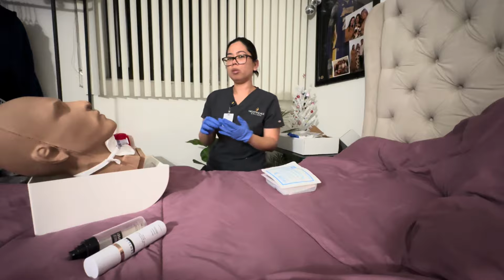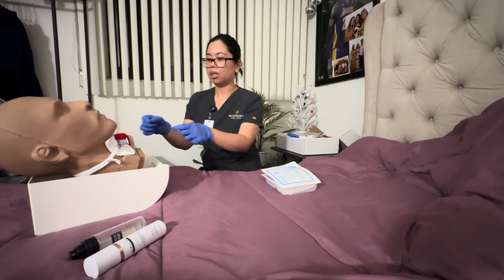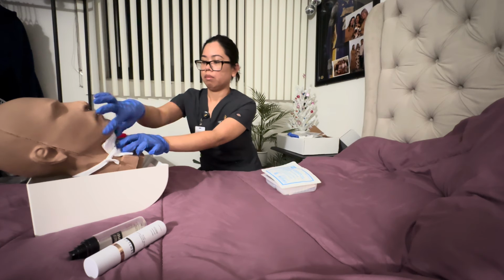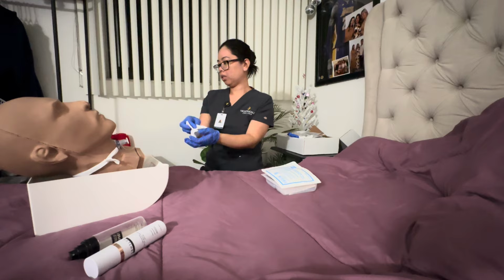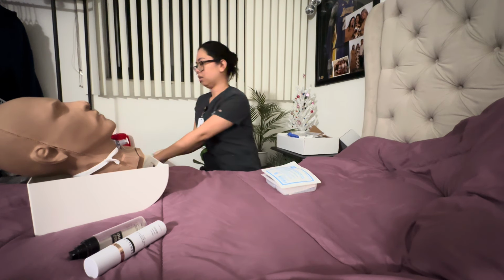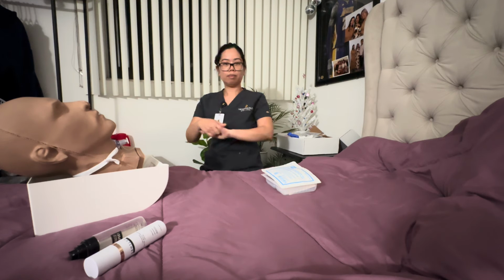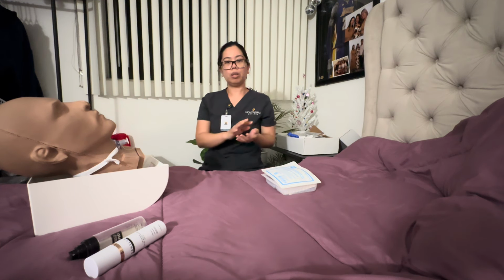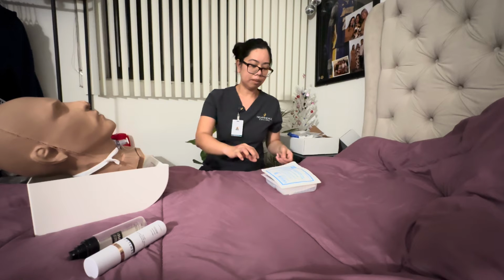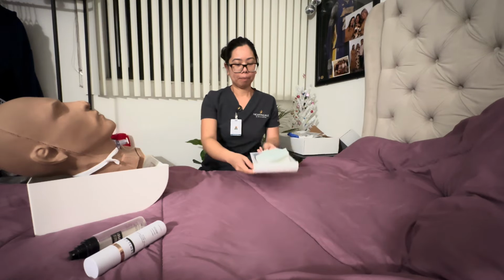I'm going to remove the oxygen source from the patient, and then I'm going to remove the soiled dressing. After removing the soiled dressing, you want to discard it with the gloves. Do hand hygiene. Now we're going to open our sterile tracheostomy kit. We want to open it away from us.